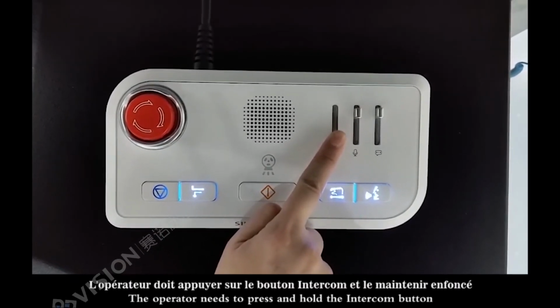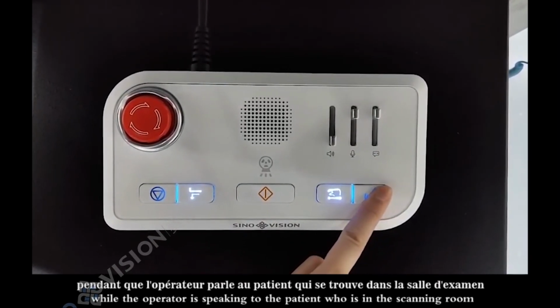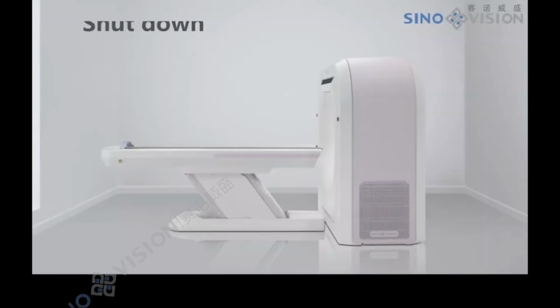The operator needs to press and hold the intercom button while the operator is speaking to the patient who is in the scanning room.